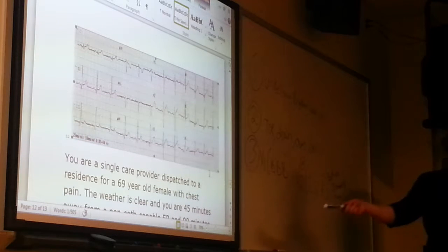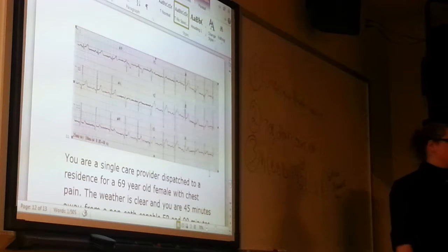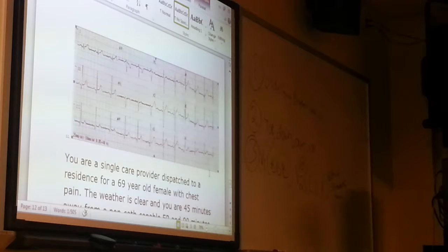Would I take this person to a cath lab? Would I activate the STEMI team? No! They will kick your butt, particularly if it's like 2 a.m. No. Okay, but we're absolutely going to transmit this to the cath center, and you're going to say, listen, this is what I have. This is a presentation of my patient.